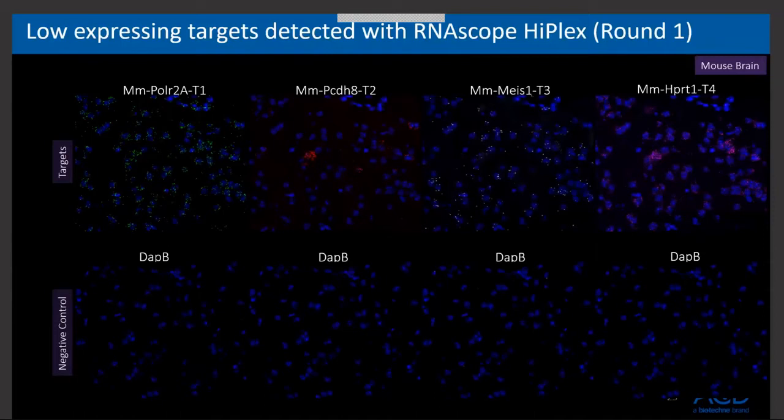optimize your signal-to-noise ratio. This assay is really very clean because of that background subtraction built into the probe design. But just in case autofluorescence creeps up throughout the assay, if you detect your highest expressors last, you're still totally fine.